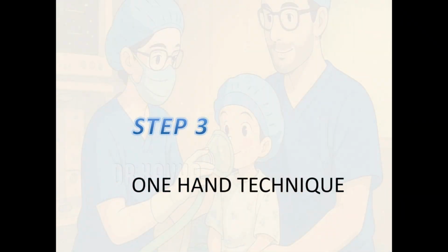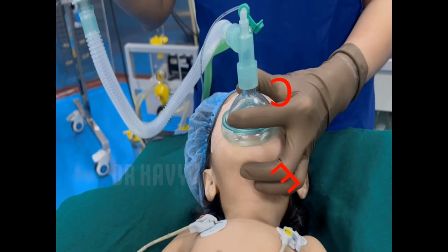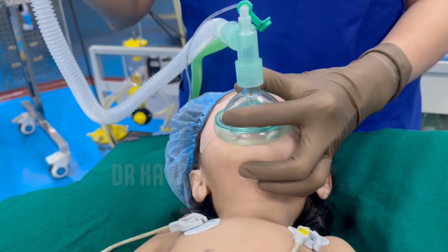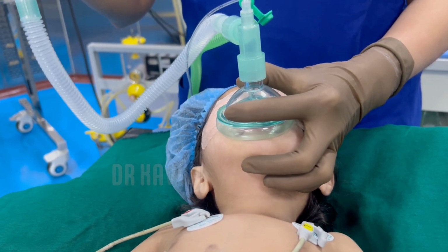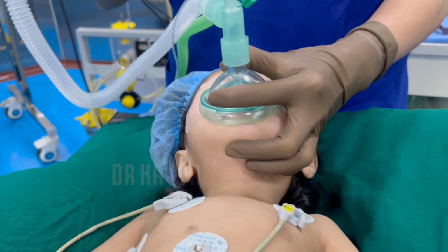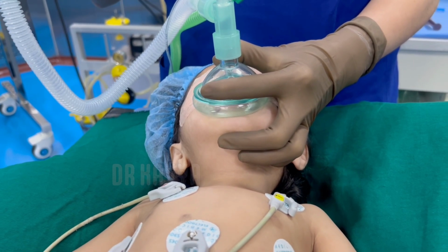Step 3. One hand technique of mask ventilation. A tight seal is achieved with the C and the E technique. The thumb and index finger of one hand form a C over the mask and are used to control the seal of the face mask, while the other three fingers form an E under the jaw to lift it forwards.